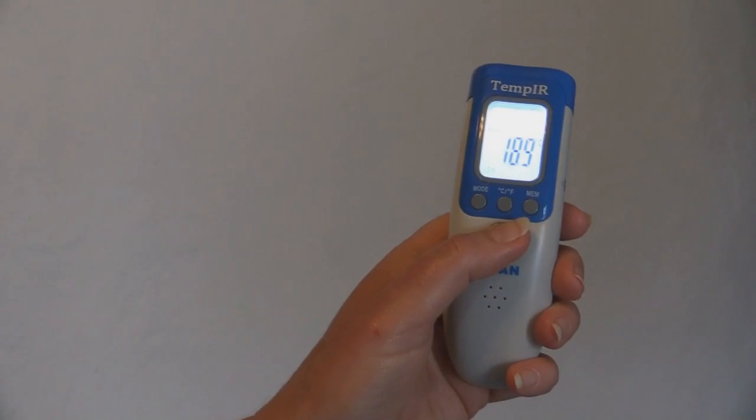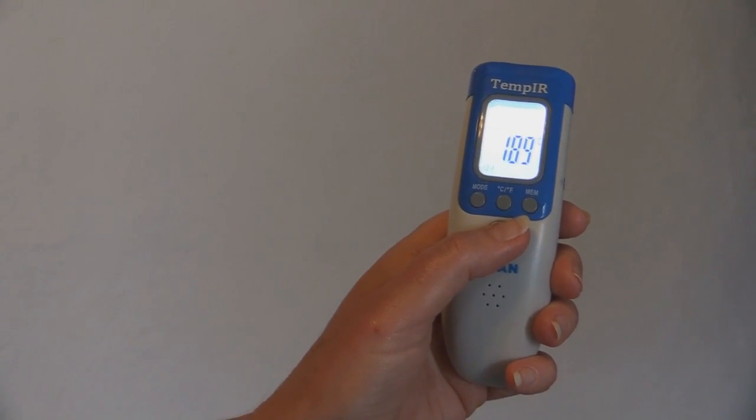To take a reading, hold the thermometer away from any surfaces and press the scan button.